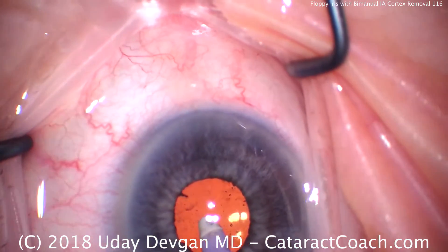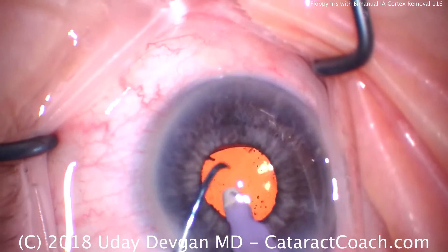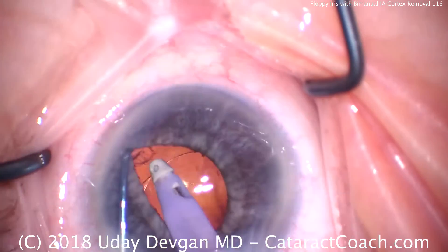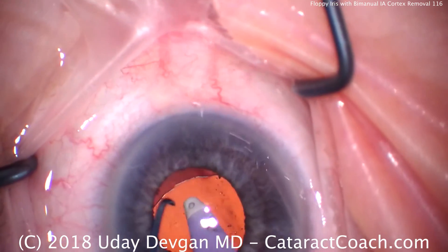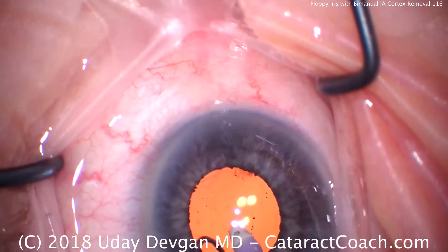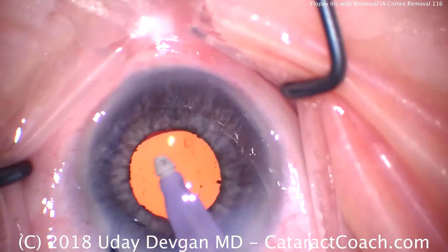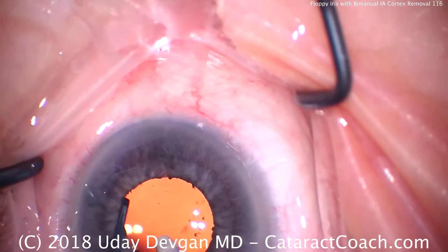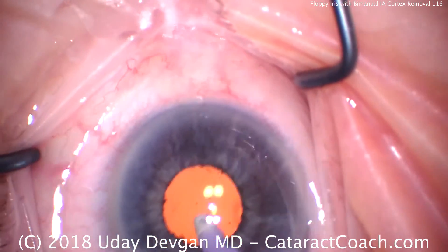Taking out the rest of the viscoelastic. Let's use the chopper — lift up that nasal iris and check. That's good, but what's that over there? There's some more — let's get that last piece out. This is a technique to use your chopper or second instrument to lift the iris to ensure that we've got all the cortex out of the eye. If you leave any cortex behind, it'll swell up overnight and it'll be right in the visual axis tomorrow. Now check that everything's totally clear.